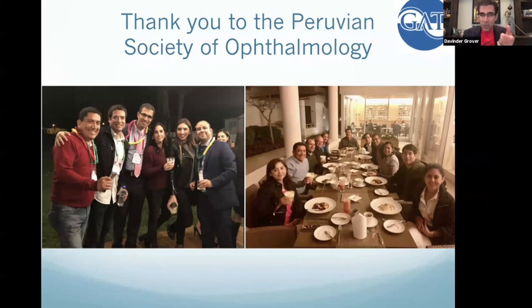Sometimes in these angle closure eyes, if the attack is broken and you just put Healon in the eye and push everything down, you can see the angle and you can do that first. So that would be my preference, to form the eye first. If I have space, then I would break the PAS, do the GATT or the goniotomy, and then do the phaco. If it's such a big lens and the angle is so small that you don't have that option, then I would do the phaco first and then maybe a hemi GATT or a goniotomy.